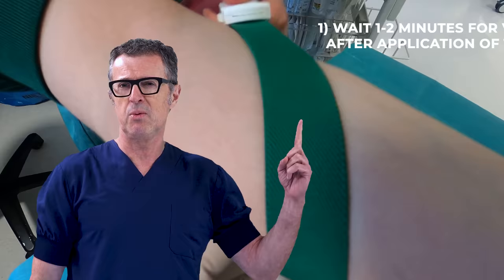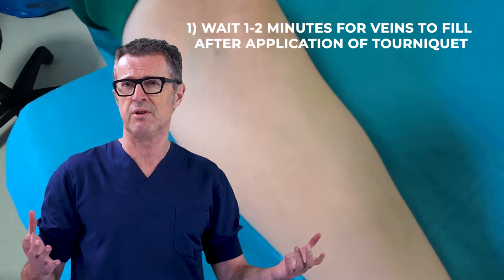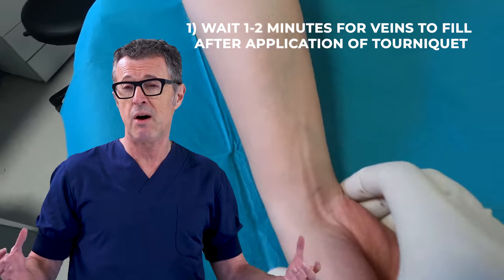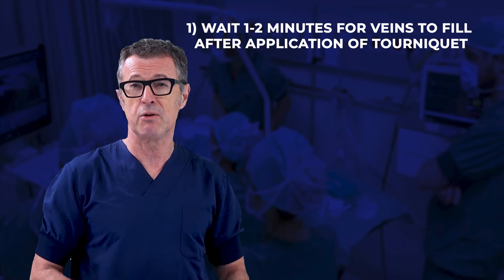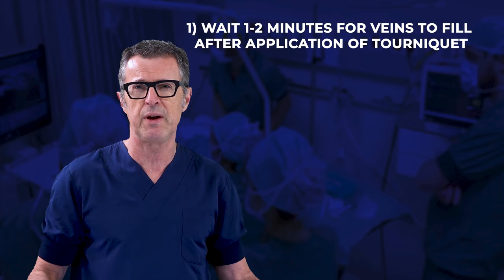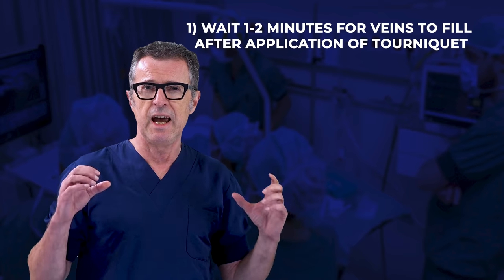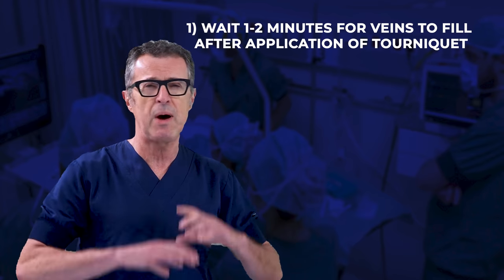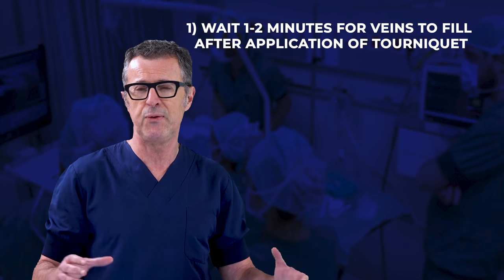There are two principles that most everyone forgets when cannulating peripheral veins. Number one: the application of tourniquet requires time for the blood to engorge the veins. While this is obvious, it is very common in clinical practice to see healthcare personnel rush the procedure without allowing sufficient time for the veins to fill after tourniquet application. The advice: apply the tourniquet and continue other work for another couple of minutes until the veins are filled and ready.